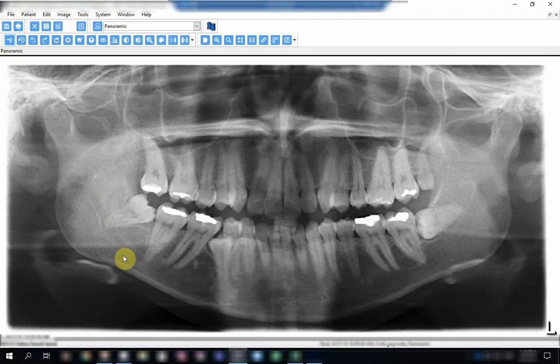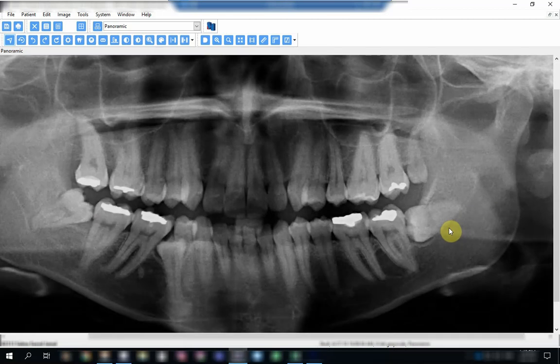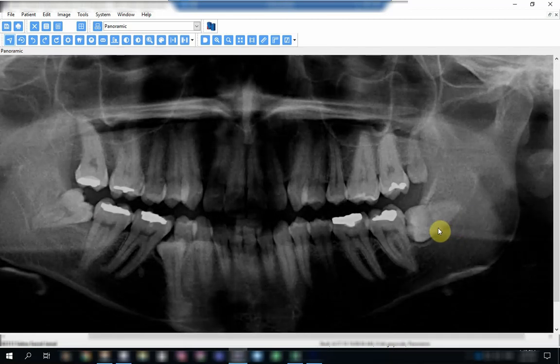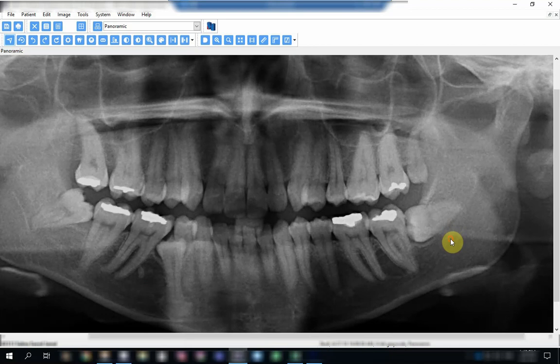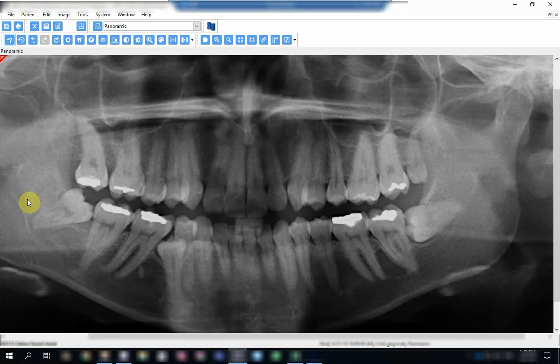Compare it to the other side—you can see that the course of the canal did not change on that side. But on this side, the direction of the canal has been changed.